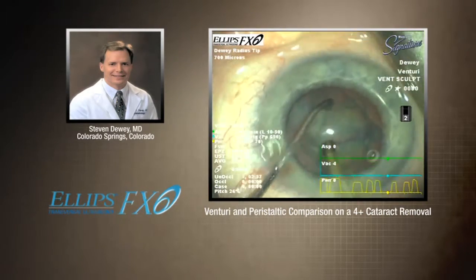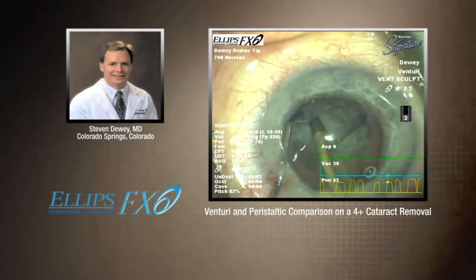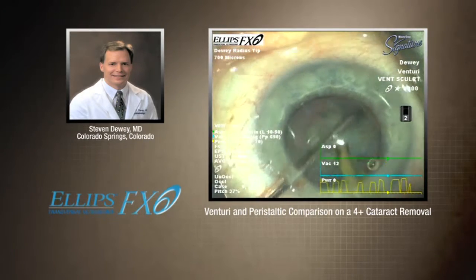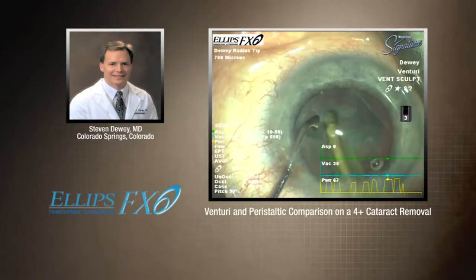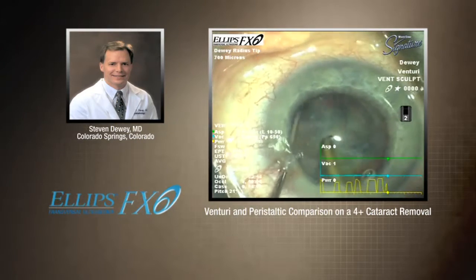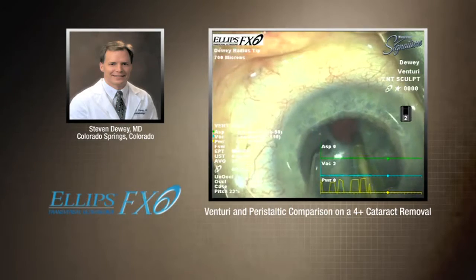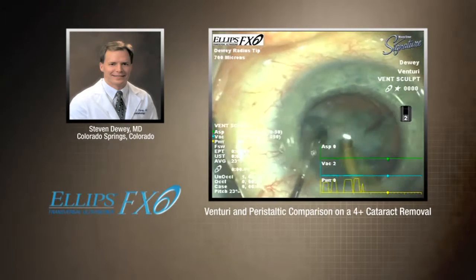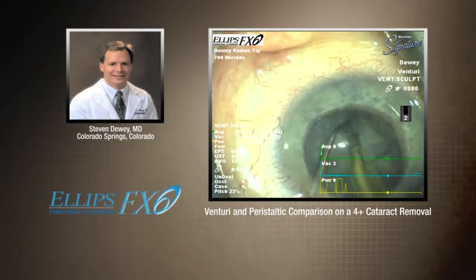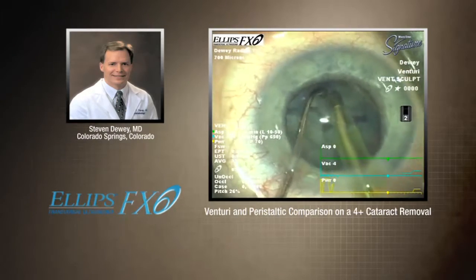This is a 700-micron needle. As a phaco nerd, I'll tell you — I think the biggest difference between Ellipse and Ellipse FX is the size of the bite it takes. Because we're now operating at a speed that is almost twice as fast, you're shaving twice as fast, the bites are smaller. Remember, because you've got that circular motion — it's going in, it's impaling. But instead of longitudinal, where it's repeatedly hammering at the exact same point, you get it to shift slightly to the side. You get a little bit more fluid, you get that great followability. So here we are sculpting, dividing, and conquering this 4-plus cataract.